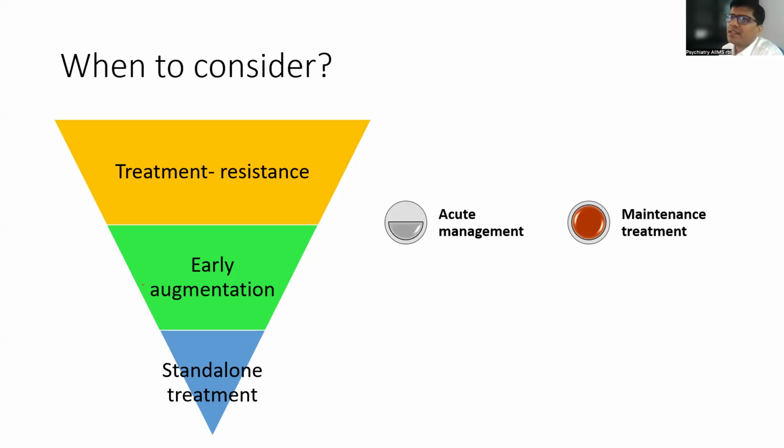But there are conditions where patients require a greater number of sessions, particularly patients with OCD, and patients with schizophrenia, particularly those who have negative and cognitive symptoms. Some of these patients, after discontinuation of rTMS, relapse again. Then you need to consider maintenance treatment with rTMS, maybe one session weekly or 2 sessions weekly.